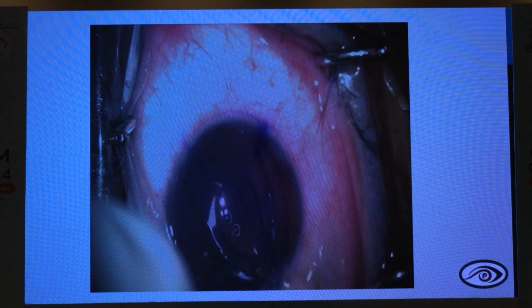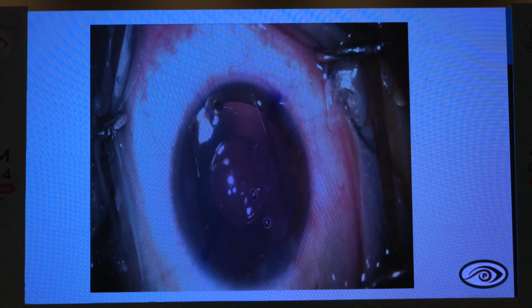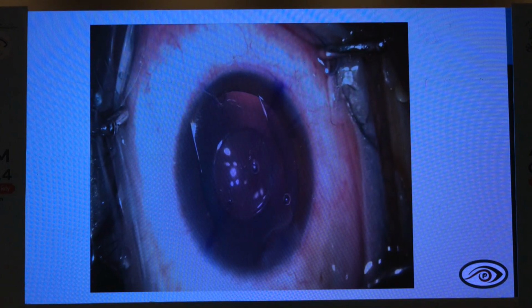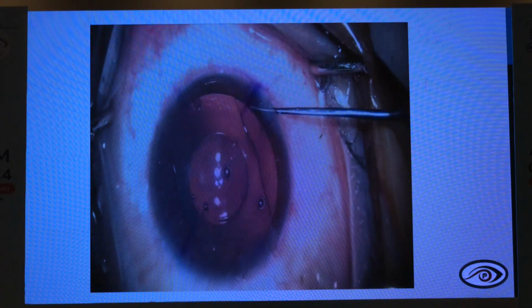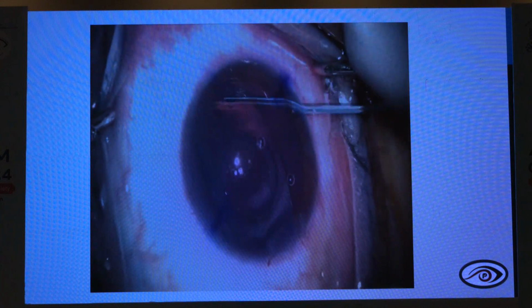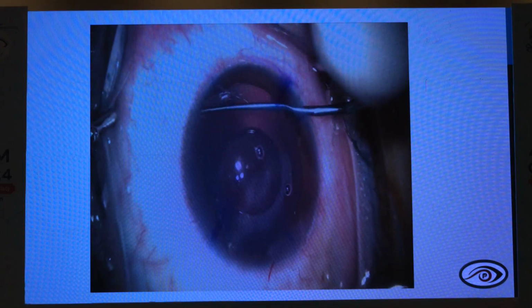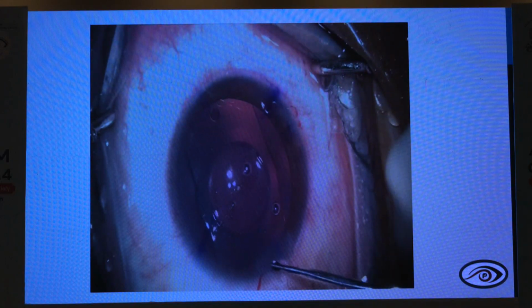Probably most of us sitting here are all fantastic phaco surgeons. I think for you, even with one patient's experience, you can get the best of results. But again, pre-op evaluation is the key. White to white, ACD, I think you have to keep it. If your pre-op workup is very good, then the procedure itself is very simple. Out of around 500-600 patients, only 1 or 2 patients might have developed cataract, and it was very easy to remove, and again you can do the cataract surgery quite easily.